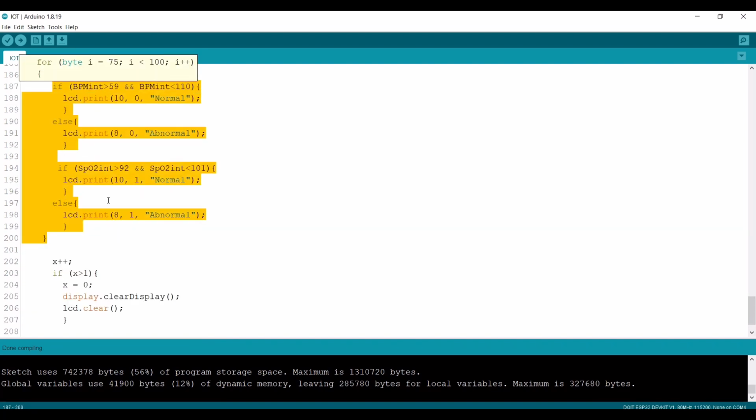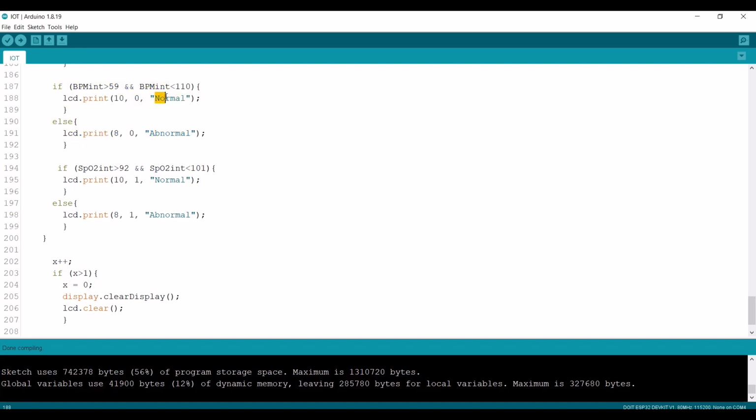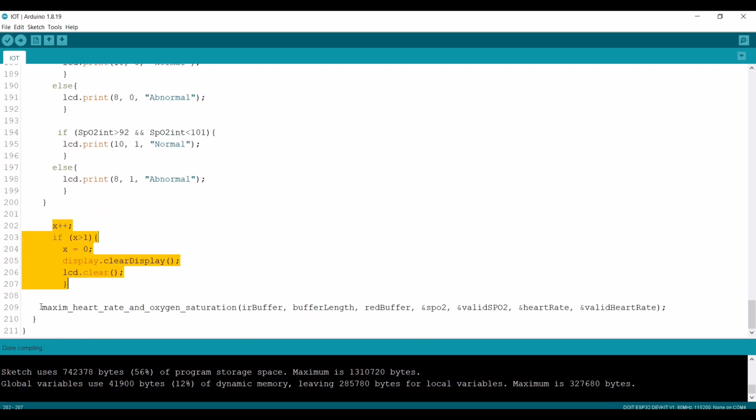And I also create a condition here. If the heart rate is between 60 and 109, the LCD will print normal, but if not, it will print abnormal. And this is for the SpO2 value. If the SpO2 value is in the range of 93 to 100%, it will show normal, but if not, it will show abnormal. And this one is to prevent the data from overlapping with the one before. After that, we gather 25 new data samples and calculate the heart rate and SpO2 again.